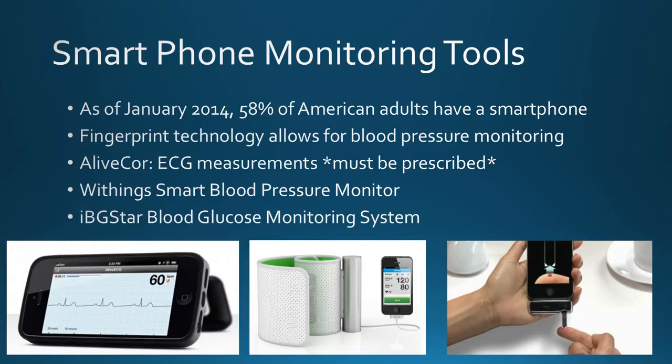However, some patients like the convenience, they like sort of the technology associated with it. Something to consider though, especially with this blood glucose monitor, is it financially viable for the patient long term? And having that discussion with them. And I didn't get into it with these devices, but you also want to research how effective they are. Do they have any testing for safety and efficacy for patients? Because if they're not measuring within a good range of what your lab tests are, you really don't want to recommend them to a patient.